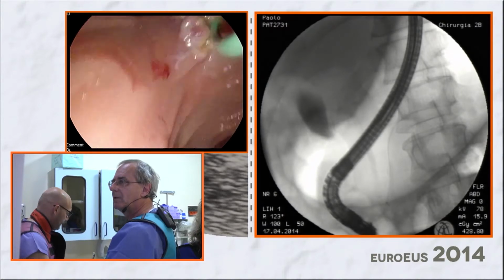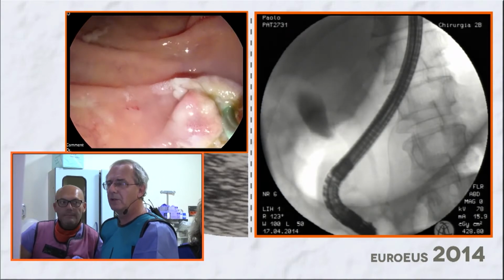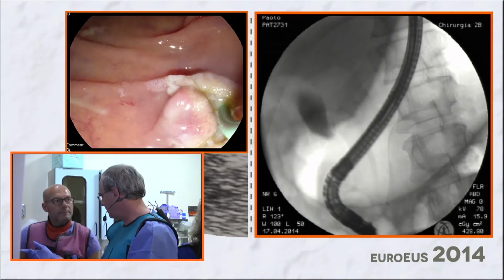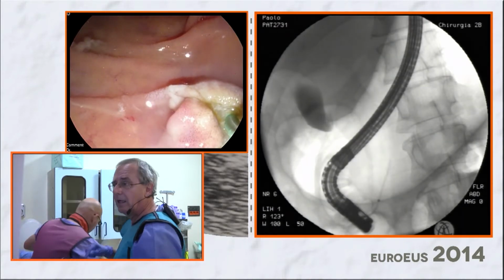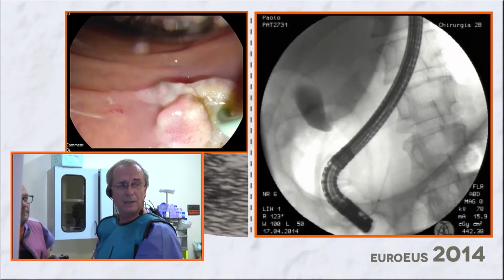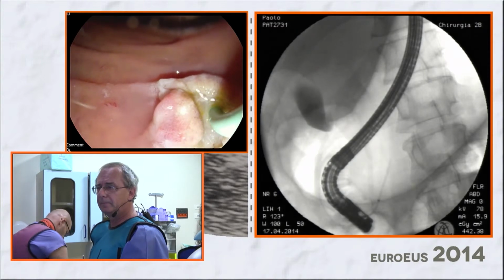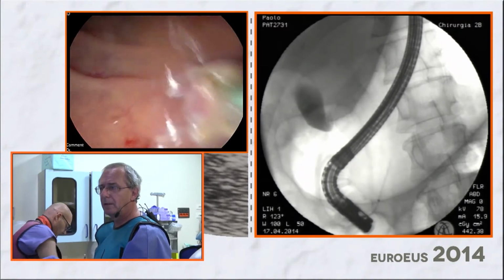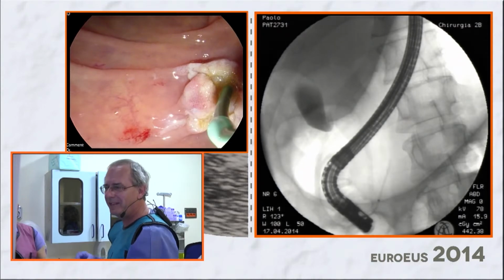Okay. So, is it free? It is free. So now the cannulotome, 1 second, just to have a look at the biliary orifice, and then I think we will finish the examination. Any question? We admire your elegance. You're a good friend, Fritz.